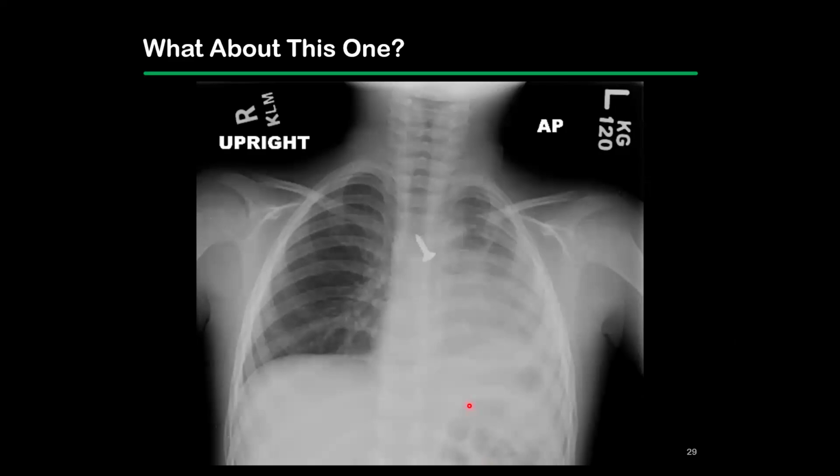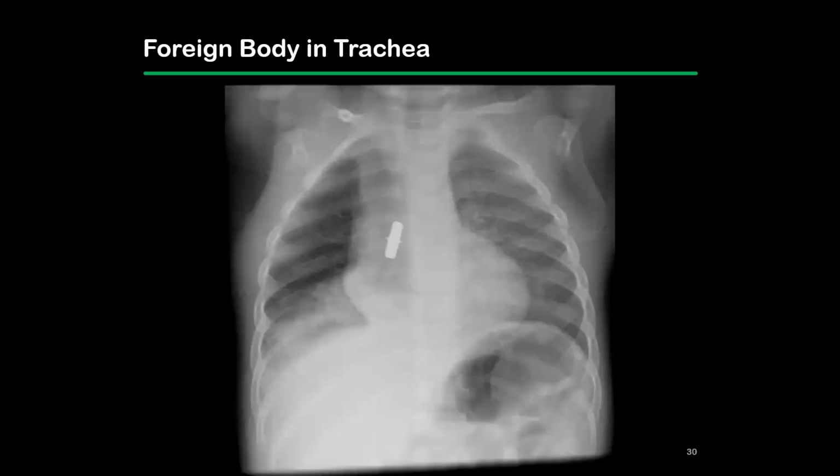So this is another foreign body that was aspirated. This is a screw, and you can see that it's causing some blockage, and then you're getting some atelectasis and air trapping. Well, not so much air trapping, more atelectasis throughout the left lung. And then this one looks like a connector of an IV or something like that, but also was aspirated, and again is causing some atelectasis in the right lower lobe instead.